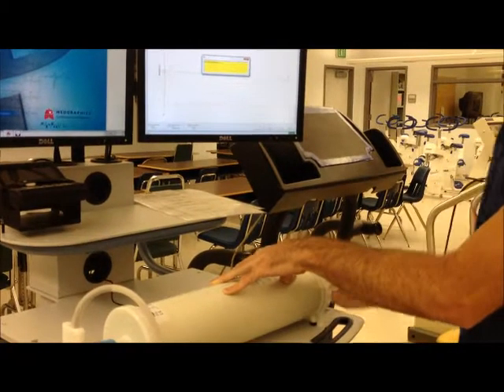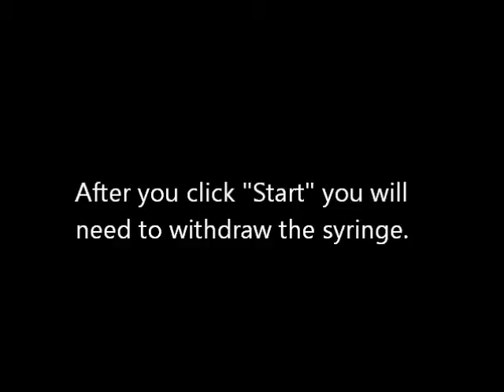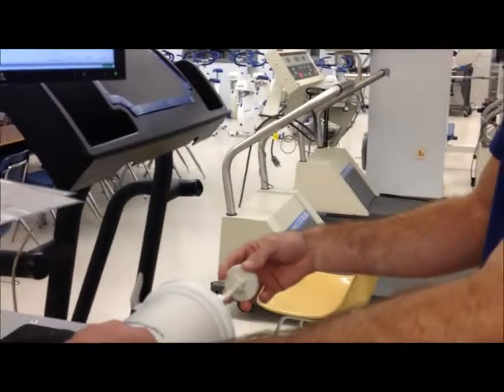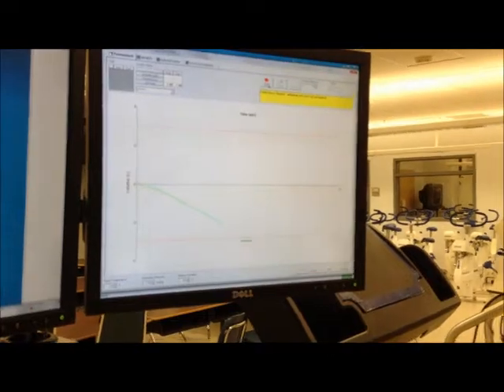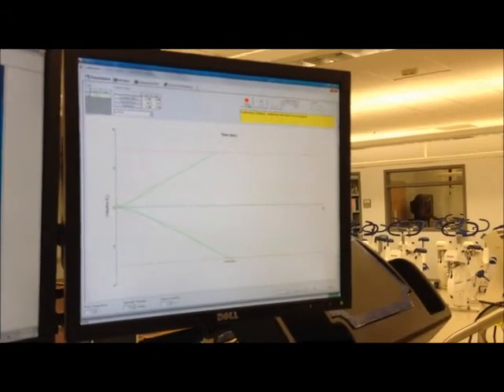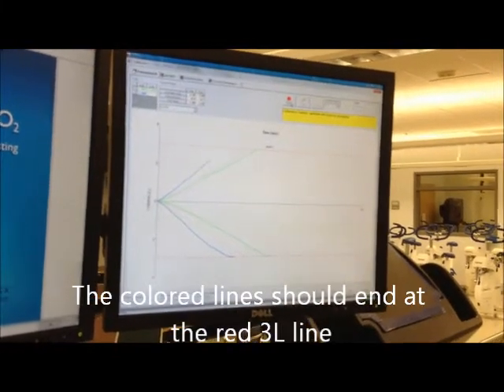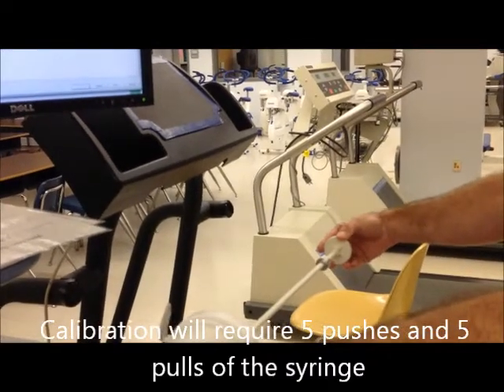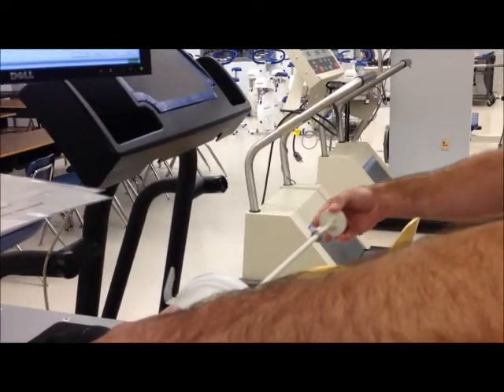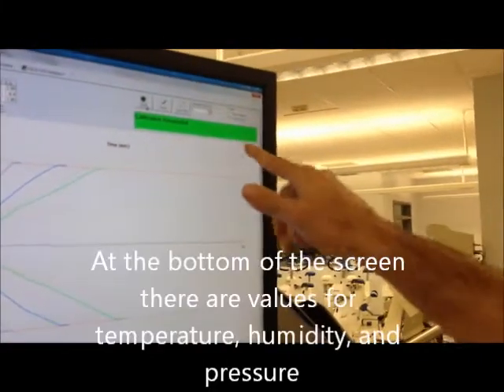To calibrate the volume, click on 'calibrate' here — that just takes a quick second. Don't ever hit the reset button. Then click start. You don't have to follow those dotted lines; they're just a guideline. A lot of times when you first turn the computer on, you will fail flow meter calibration — it's just getting used to the 3 liters of air being pushed and pulled through the flow meter. It doesn't matter if you start with the fast ones or the slow ones, as long as you do a varied rate of injections and withdrawals.